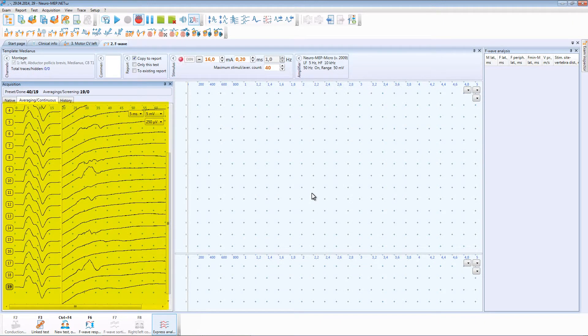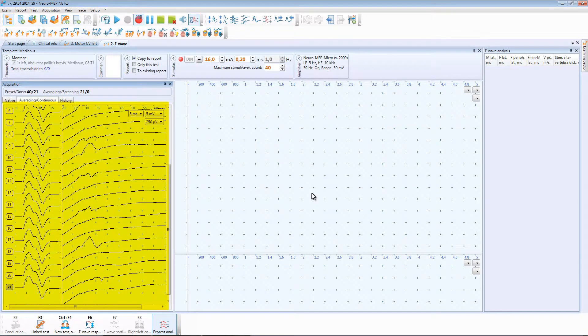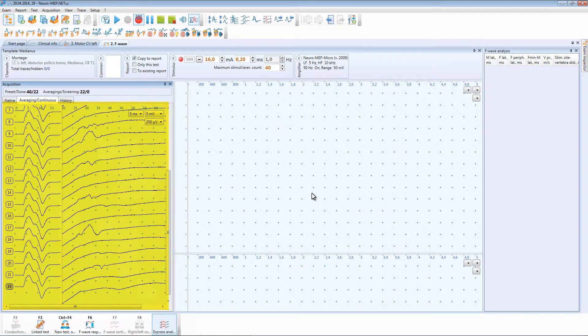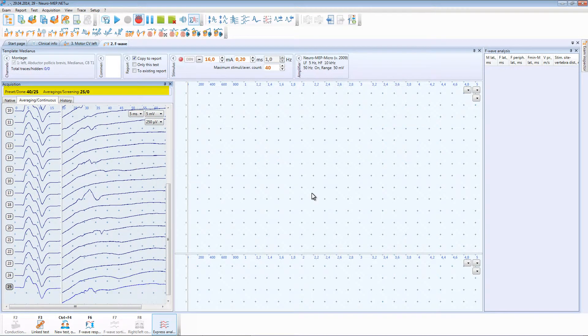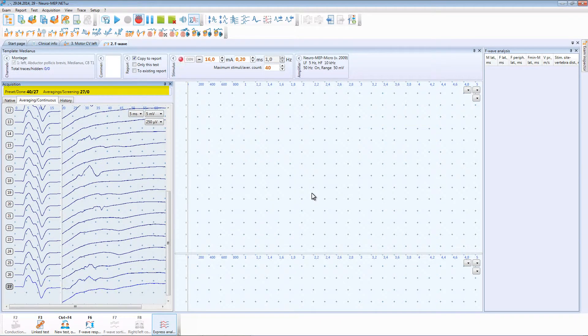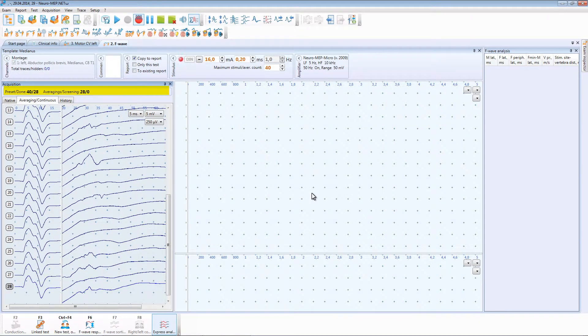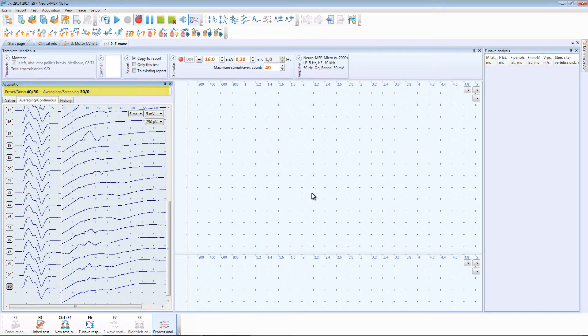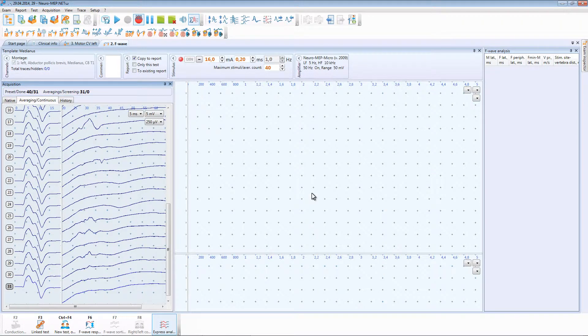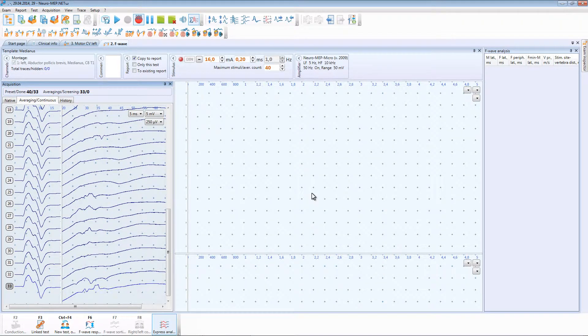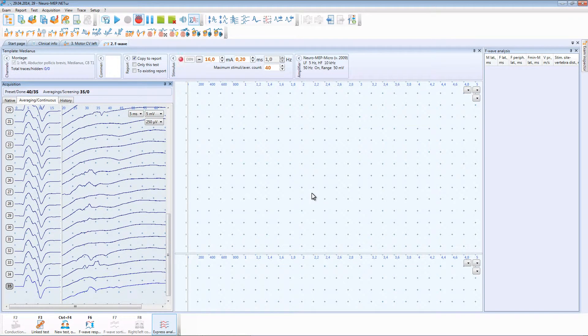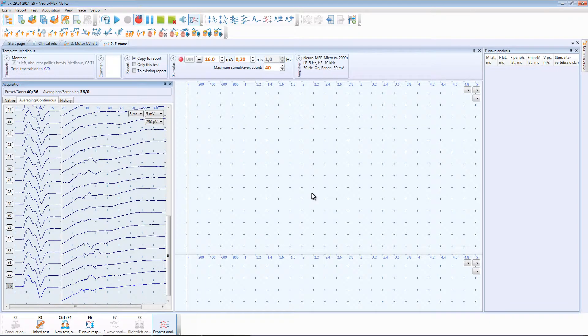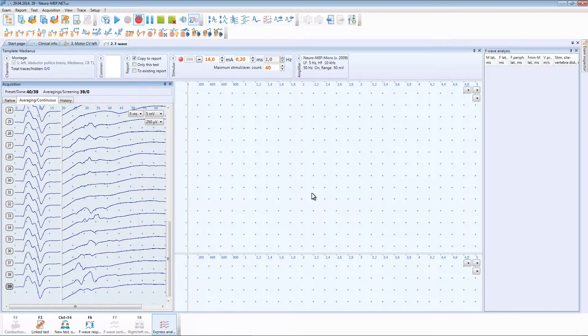In the main window we can see obtained M responses and F-waves. At the top part of this window we can see the so-called counter showing the required number of F-waves and number of currently obtained F-waves. The acquisition stops when the preset number of F-waves will be acquired or it can be stopped manually.